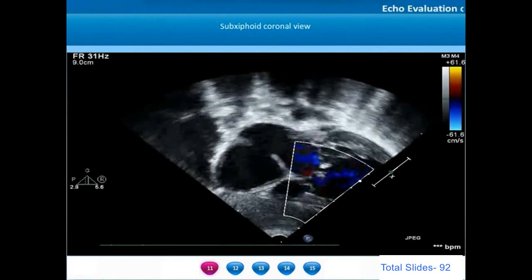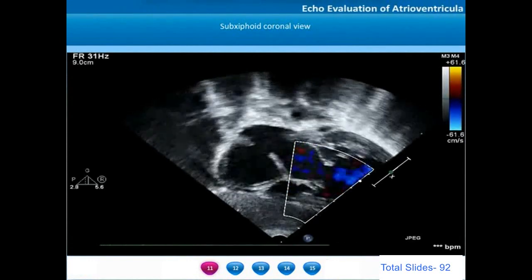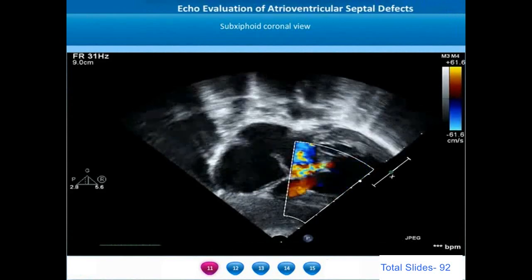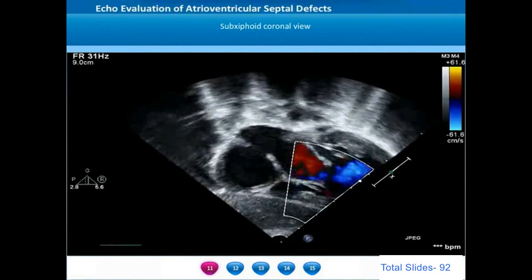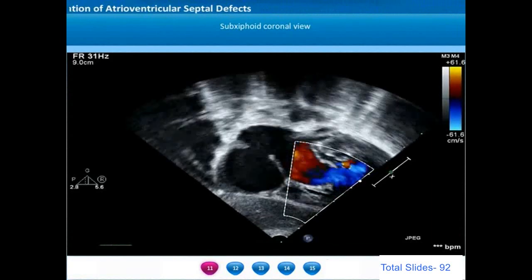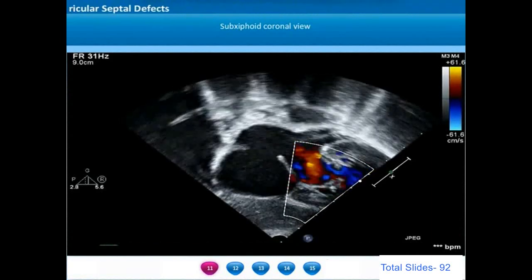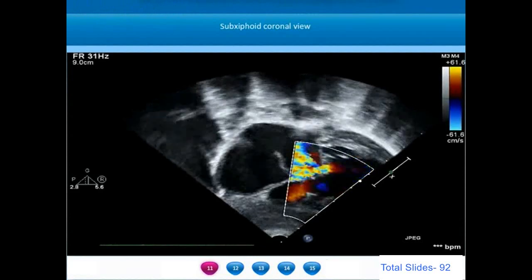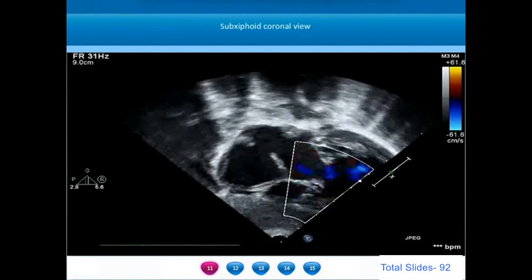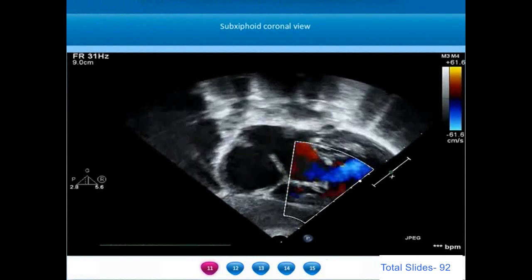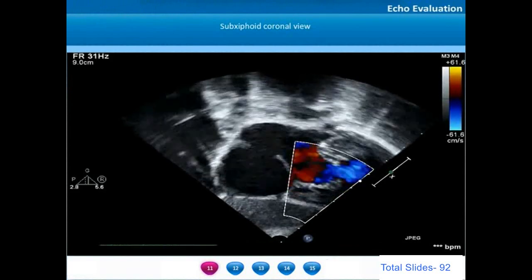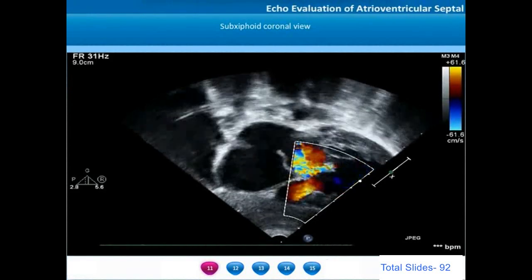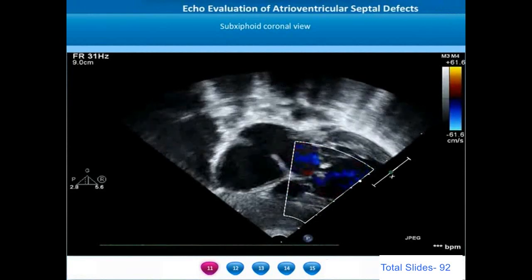On a subcostal coronal view, we can again notice the inlet ventricular septal defect located beneath the inferior bridging leaflet. There is an additional secondary atrial septal defect. This can be appreciated when we make a very posterior sweep in the subcostal coronal view to get the structures below the inferior bridging leaflet.